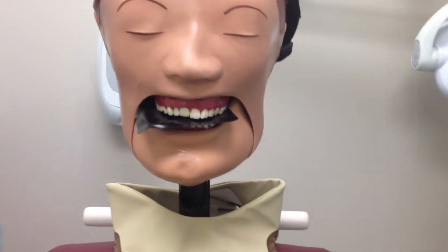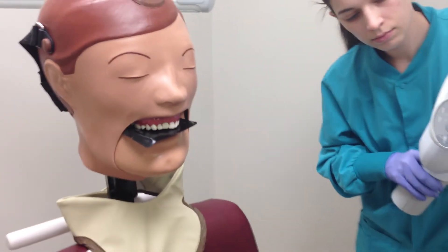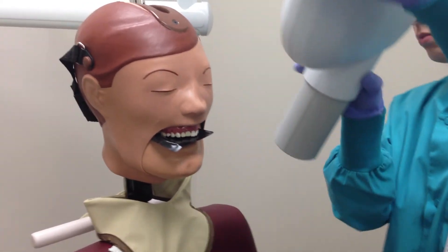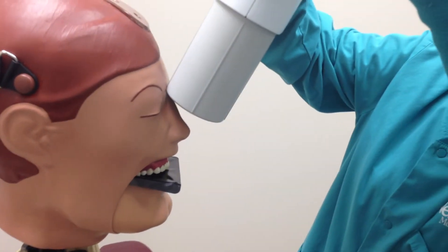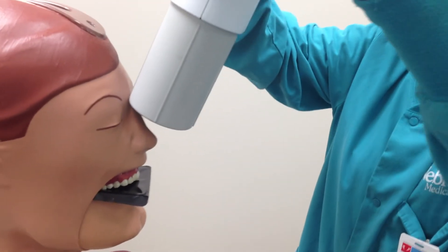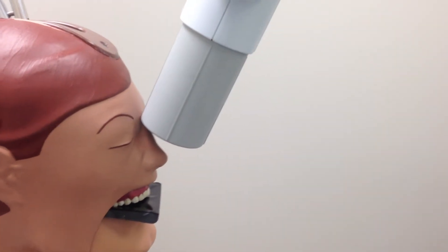Now position the PID such that the central ray is directed through the midline of the arch toward the center of the receptor. Position the PID such that the central ray is aimed with a vertical angle of 65 to 70 degrees, and the horizontal angle is 0 degrees, centered over the bridge of the nose.